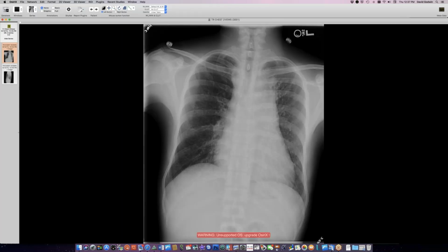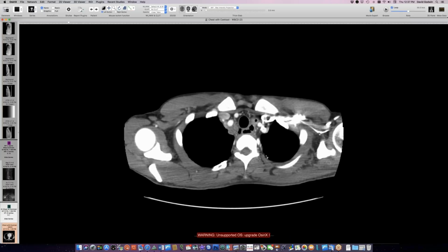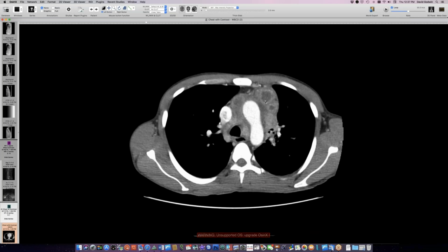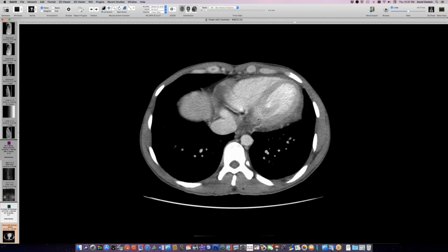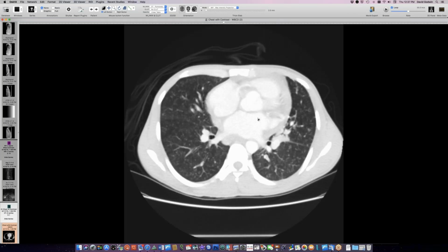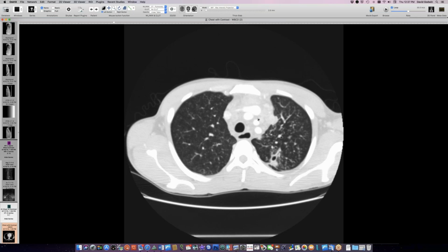Yeah, that's really impressive. Okay, so here's a fellow at Harborview, a Mexican patient with mediastinal widening and fever and night sweats and weight loss symptoms going on over several weeks. I don't think he spoke a lot of English. He does have this mediastinal widening and these fine nodules throughout the lungs. On CT, he's got a lot of low attenuation lymphadenopathy throughout here, and he also had back pain.